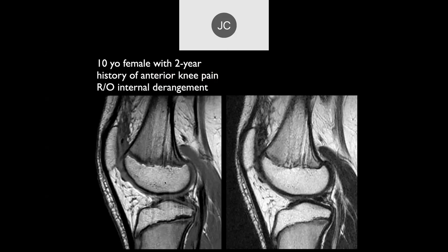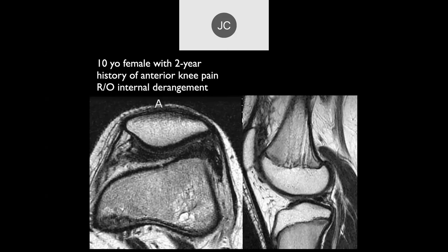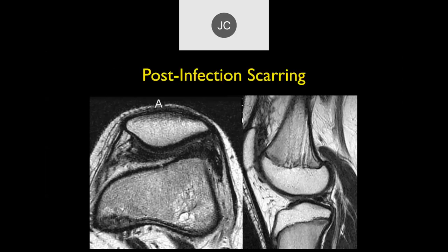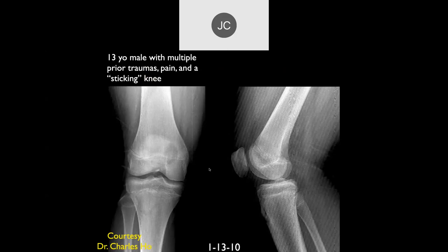A 10-year-old female with a two-year history of anterior knee pain — ruled out internal derangement — shows dark, low signal intensity in the posterior patellar space on sagittal images. The critical history is that this patient was previously treated for methicillin-resistant Staphylococcus aureus. This low signal represents post-inflammatory scarring after treatment for methicillin-resistant disease.